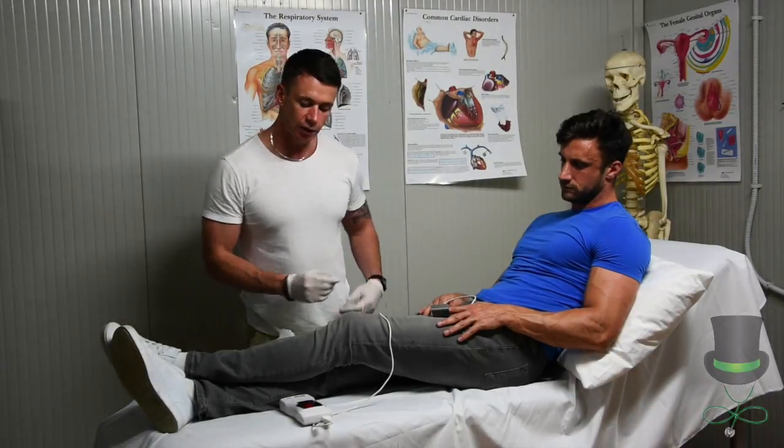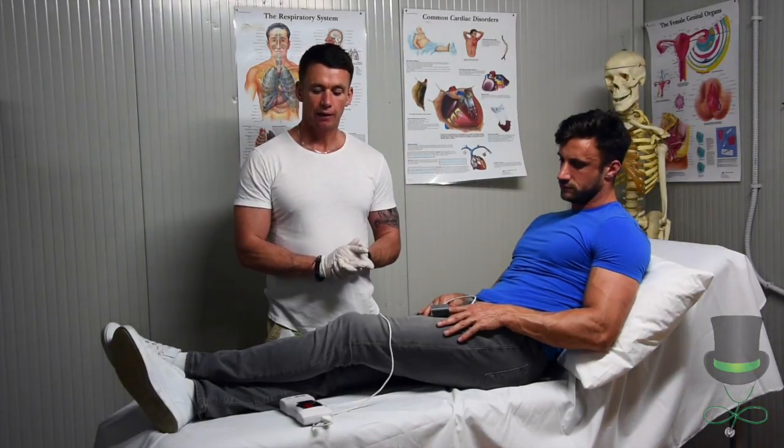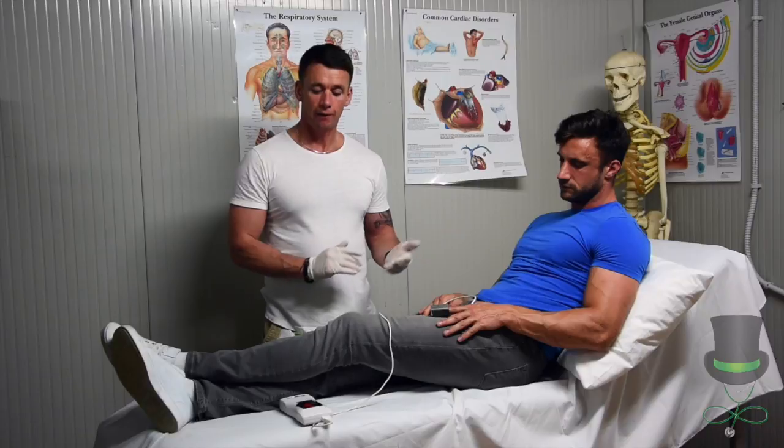Ensure that the oxygen saturation level is above 94%. Anything under and the patient will require oxygen.